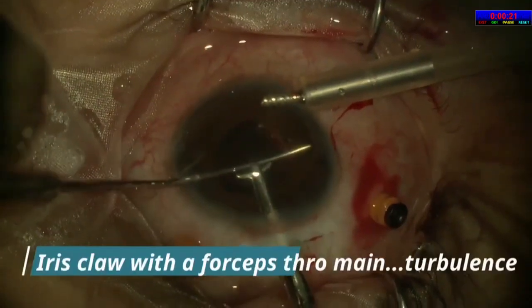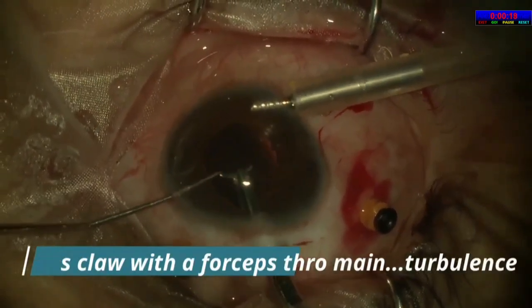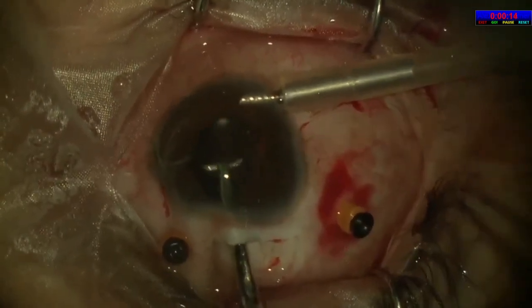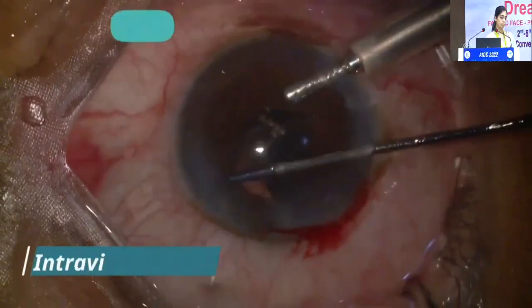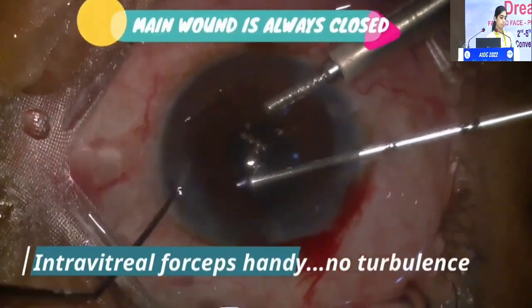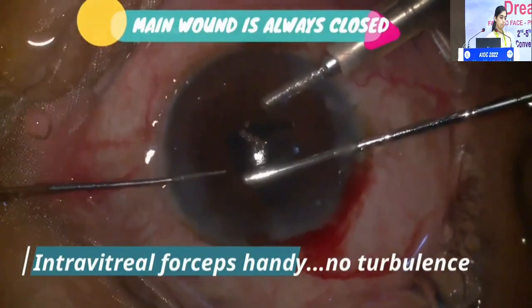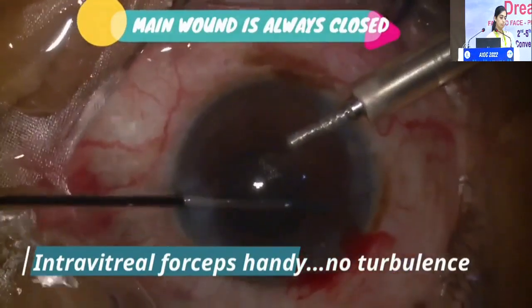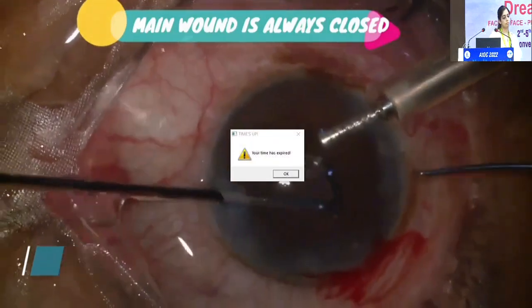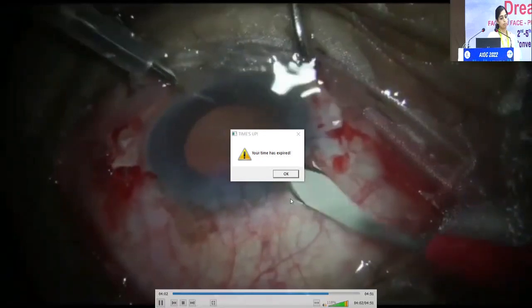When putting an iris claw IOL in such a case with a pars plana port, one faces a lot of turbulence, and sealing the pars plana port with air becomes difficult, as air can go above and below the iris claw destabilizing it. A better technique is to use intravitreal forceps to hold the iris claw through one limbal side entry and tuck with a Sinskey hook through the other — the same entries used for the extended posterior vitrectomy. This obviates the need for air exchange, and the procedure can be performed under topical anesthesia with much better chamber stability as the main wound remains closed.